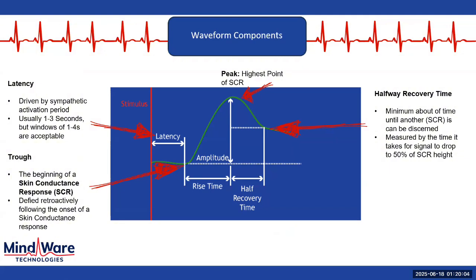So one thing we're going to be looking at is skin conductance, its overall level, whatever that baseline skin conductance level a participant might have. So this is something we might notice during our actual baseline period, before the condition begins for your experiment. So the actual level that they're at is something that we can look at.